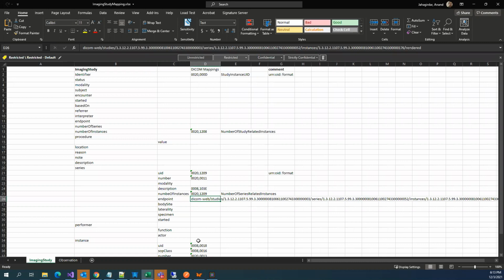Do PACS already implement this? At least, I am not very sure which PACS are having this full-fledged DICOMweb interface. At least on the Siemens side, I don't see any PACS having that full DICOMweb implementation. Neither GE, I know.